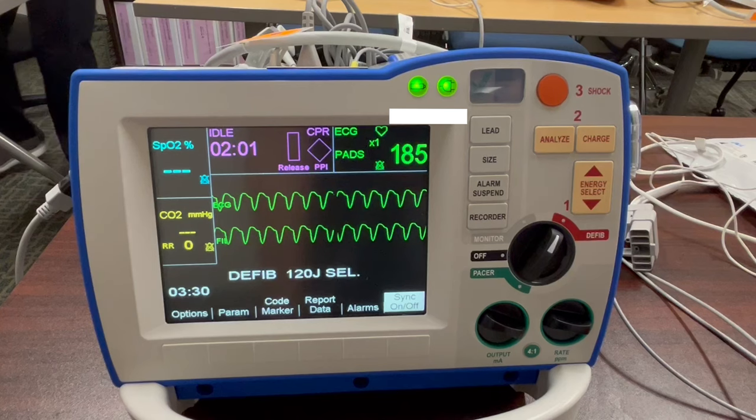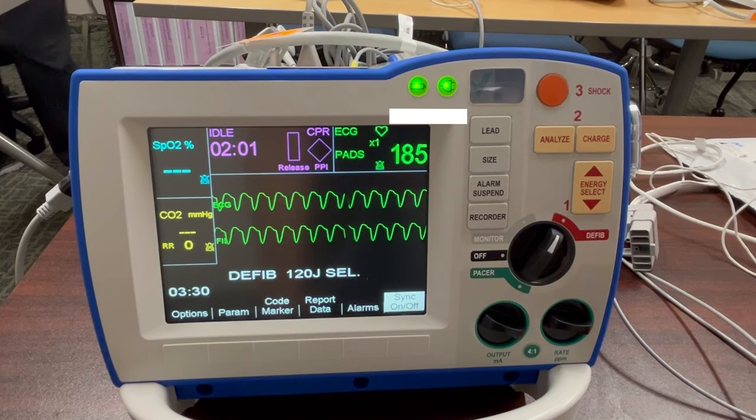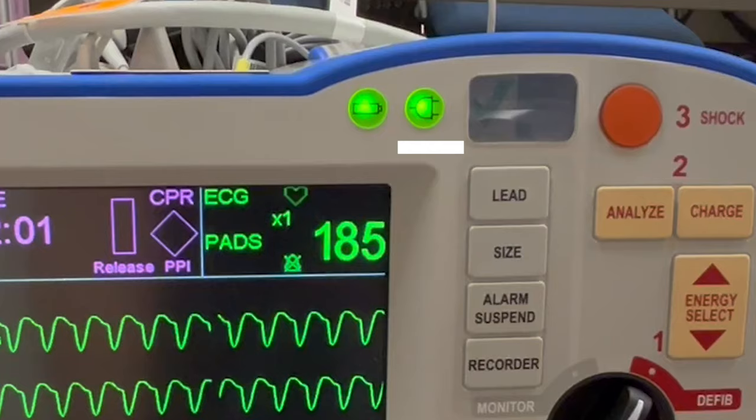The top two lights are the battery indicator. While the machine is plugged in, the battery should be green once it's fully charged, and this light shows you whether or not it is plugged into the wall.